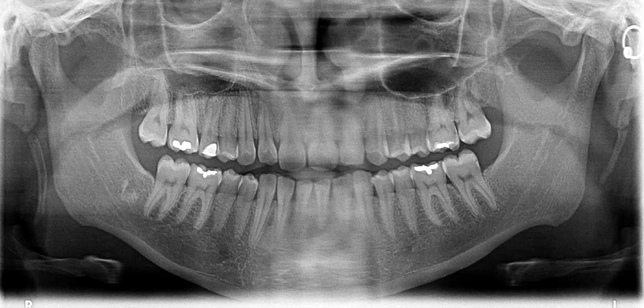Hey guys, how are you? This is Dr. Kim. Once again, I'm going to be using the same radiograph for this question.